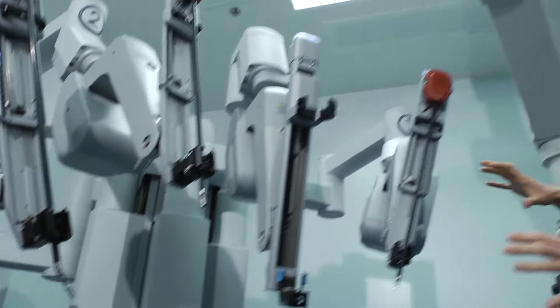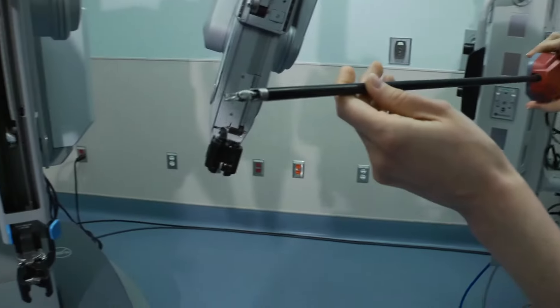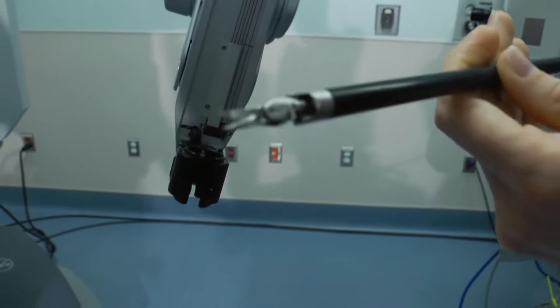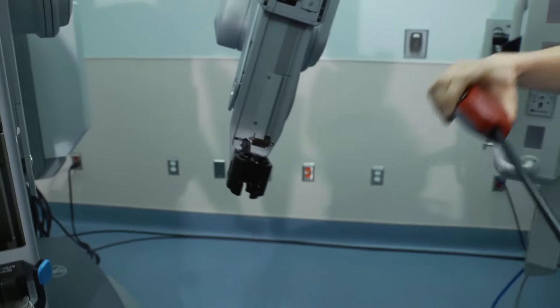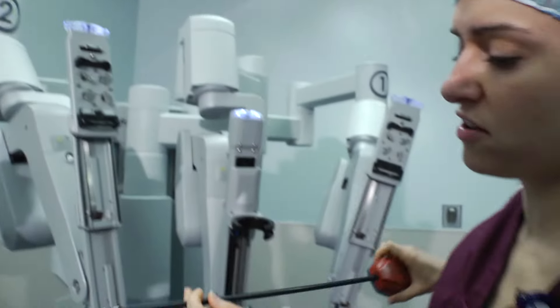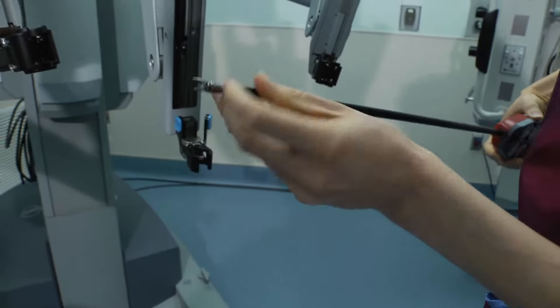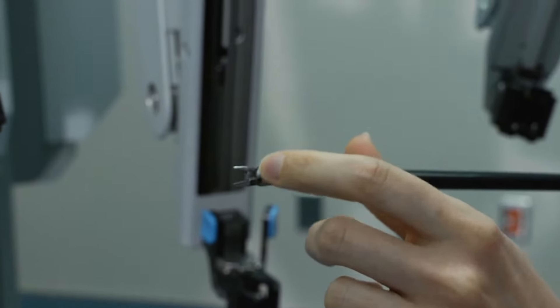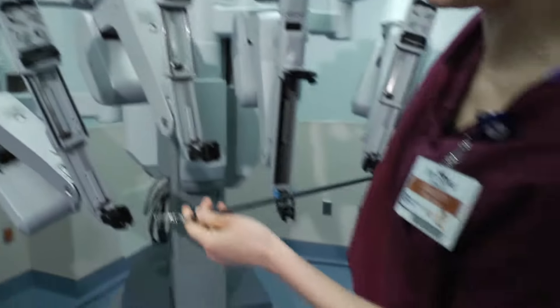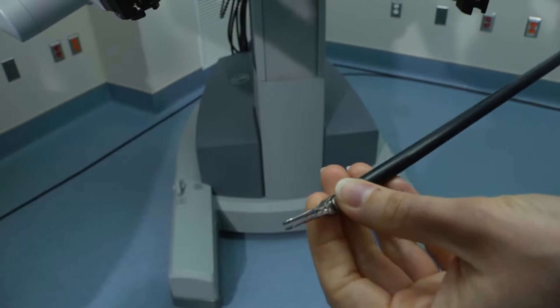To show you some examples of the instruments — this is a scissor, which we use for dissection. It's a tiny little thing, but inside the console it looks huge because of the magnification. This one is called a suture cut needle driver, which we use to drive sutures; it also has a little scissor inside to cut sutures. And this one is called a pro grasp, which we use to hold tissue — hold it out of the way, hold it aside, hold it for dissection.